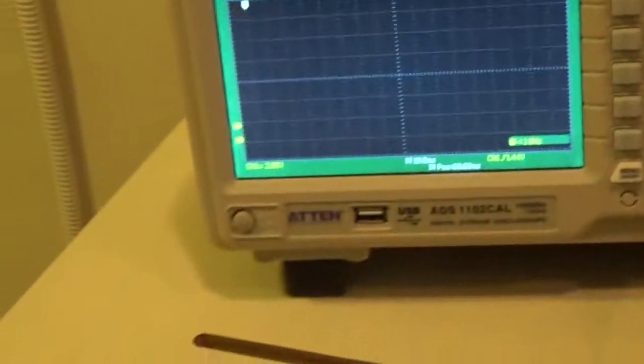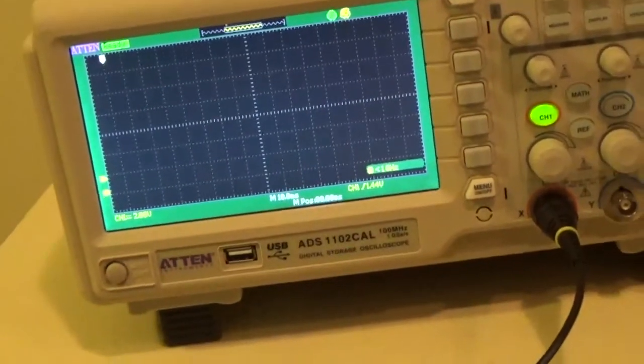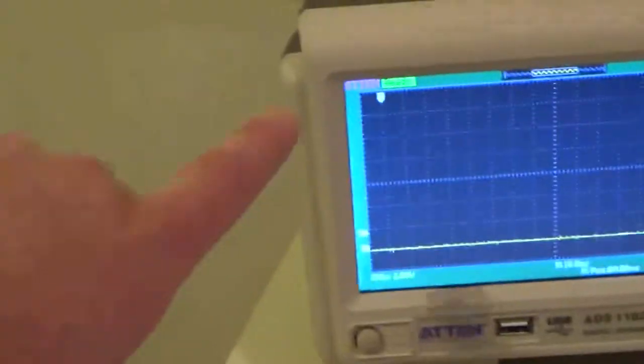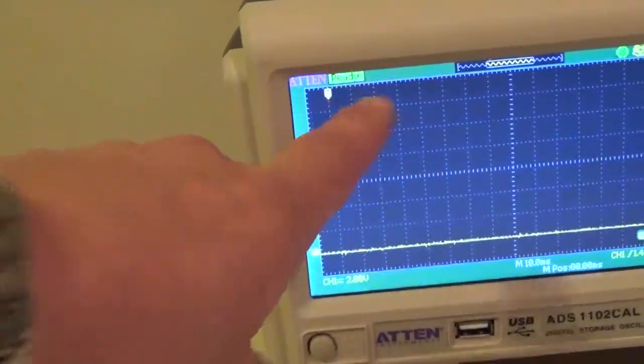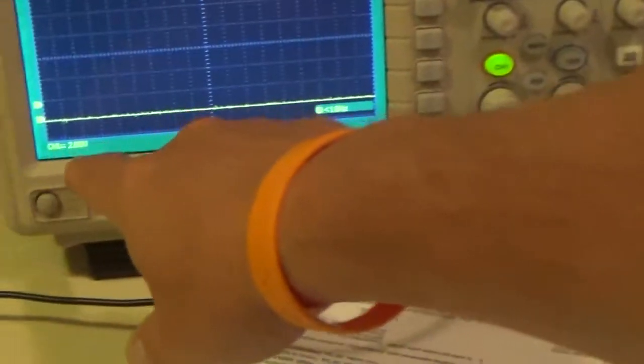So right now, for the most part, your scope is set to at least try and see if we can catch trigger it. Okay, so let's get it hooked up and then we'll come back. Okay, so we got our ready signal on the scope. As you can see, it says ready. It's ready to trigger. Everything's set the way the book says.